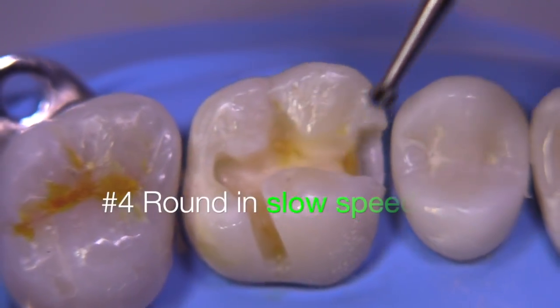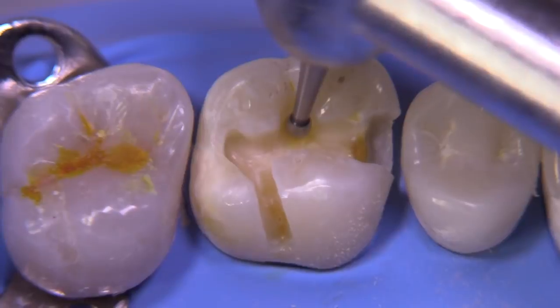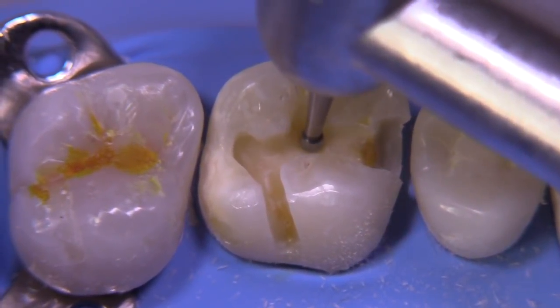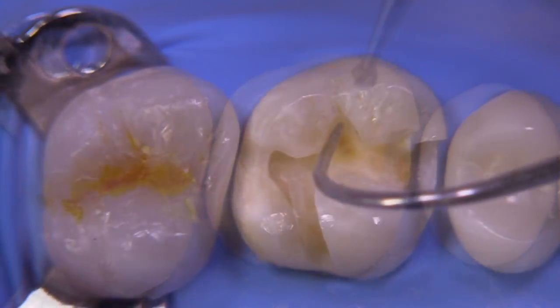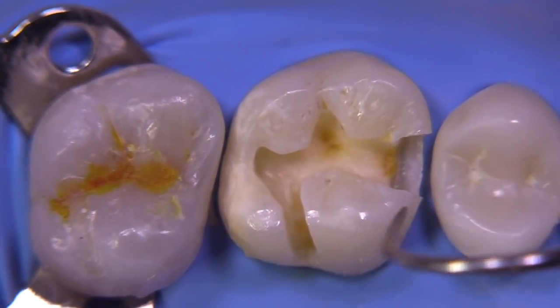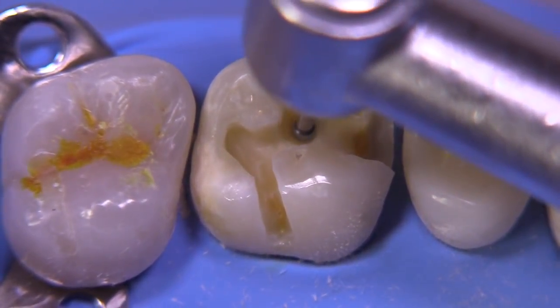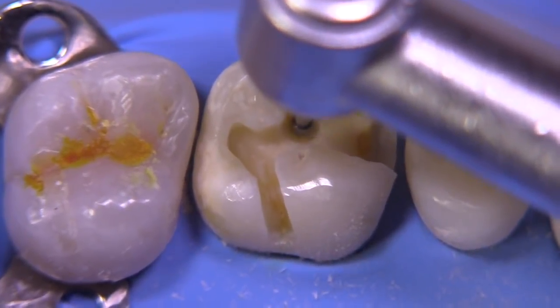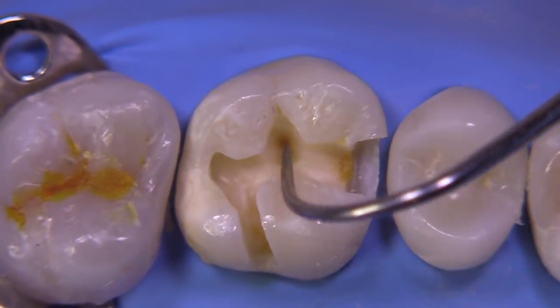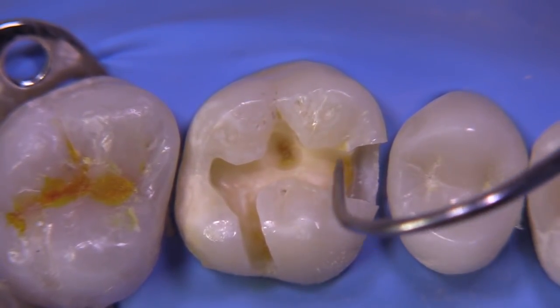Now we're ready for our round burr — I'm going to utilize a number four round burr. We could have picked up a six or an eight round burr, but the key is to think big. We just work peripherally around the lesion and then work ourselves down into the center of it, being careful not to push too hard and checking with the explorer for any sticky spots. If you scrape the explorer across the caries and it leaves a little dusty powder, that's a little bit too soft. I like to get it to the point where, while you scrape it, it feels glassy.